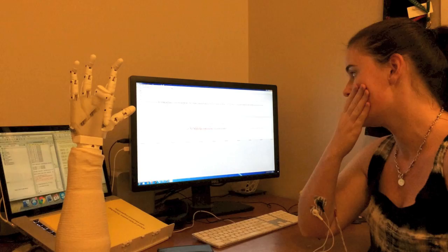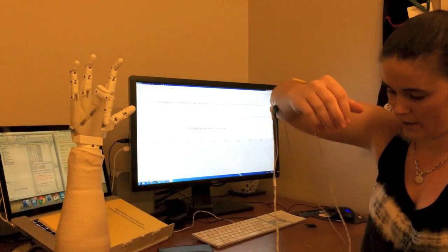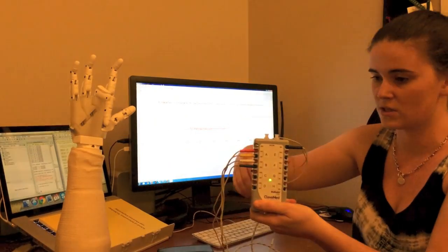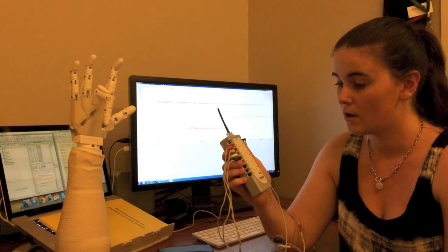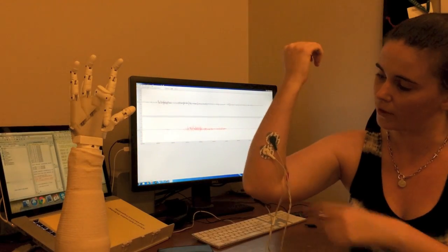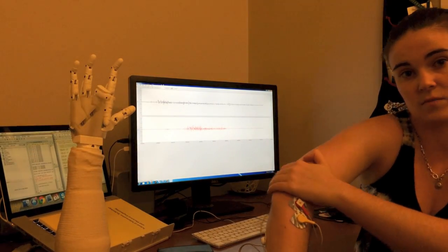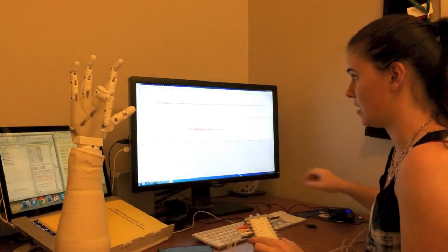how it all works. As you can see here, I've got my arm wired up to a device here. This device is designed for taking readings all over the body, and I've just got one on the top of my arm, one on the underside of the arm, and then there's just one at the back. That's just my ground electrode. So this here is going to be talking wirelessly to my computer.